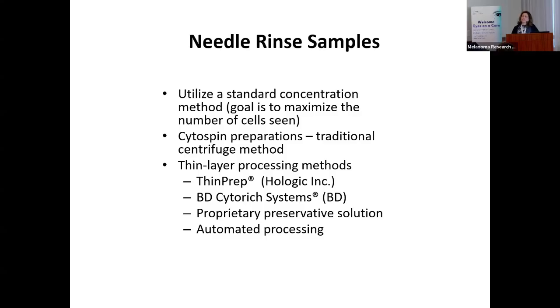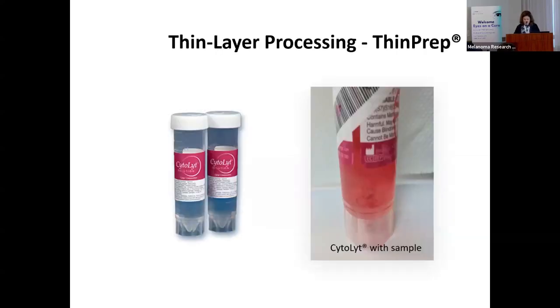So when we collect a fine needle aspiration from a small sample, Dr. Singh will put the needle in the tumor, he'll take the needle out, and he'll rinse all the cells he collects from that needle into a liquid. You can do that in a variety of ways. I'm going to show you what we do here, but the only thing we really need to know is that these methods are methods of concentrating the cells.